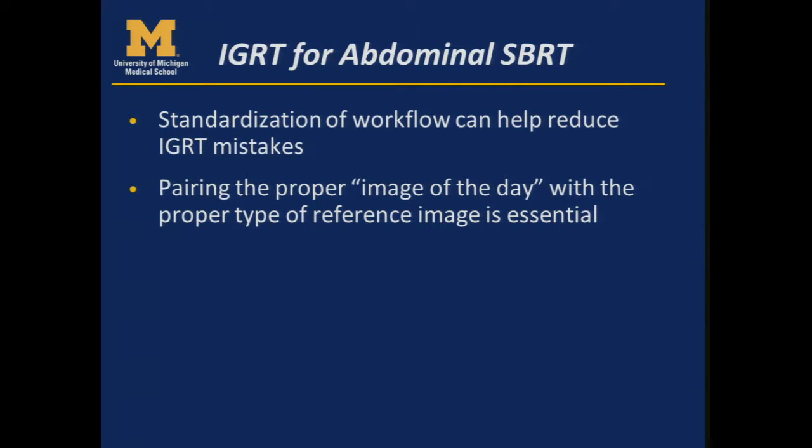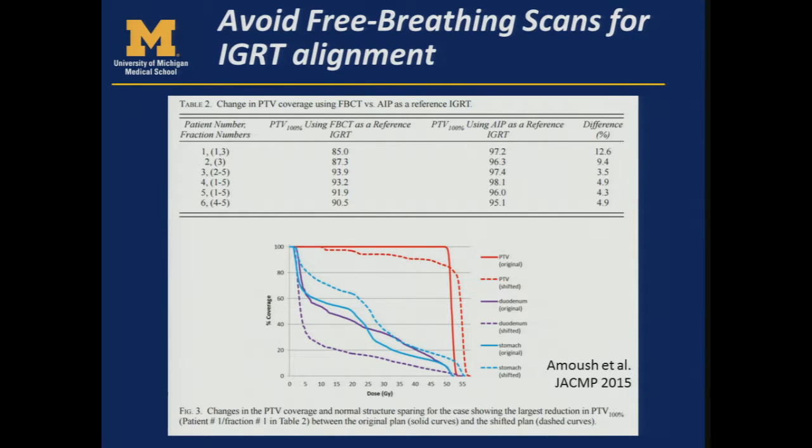So moving on to IGRT, I think one important thing to keep in mind is that standardization of workflow can really help reduce mistakes in IGRT. And pairing the proper image of the day with the proper reference image is really, really important. One thing that you want to try to avoid when at all possible is free breathing scans for IGRT alignment.